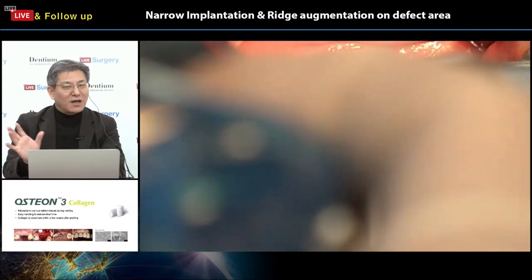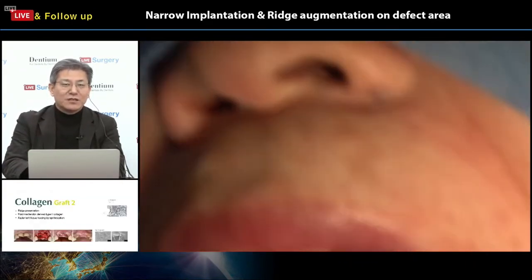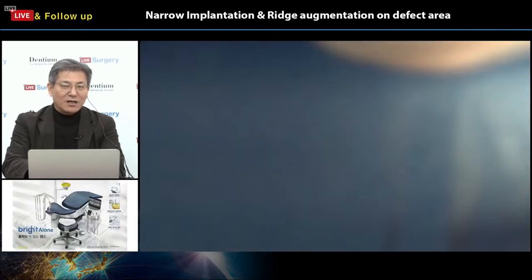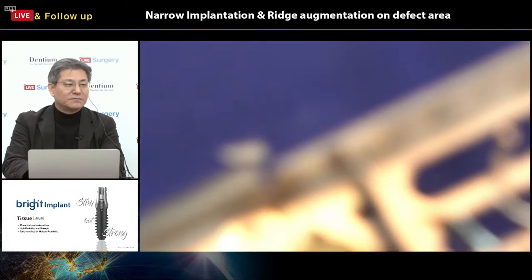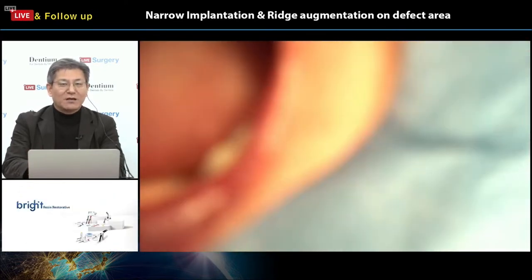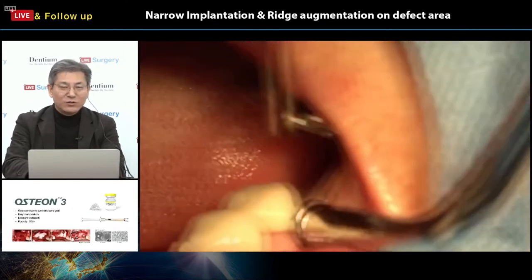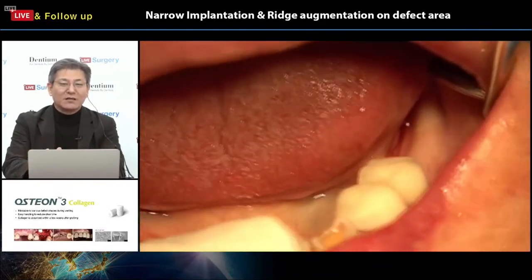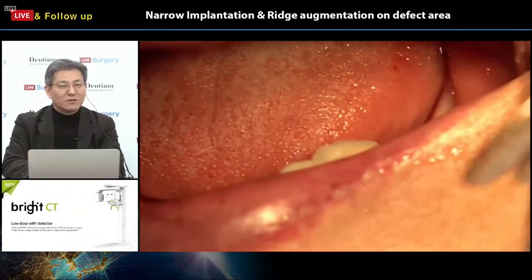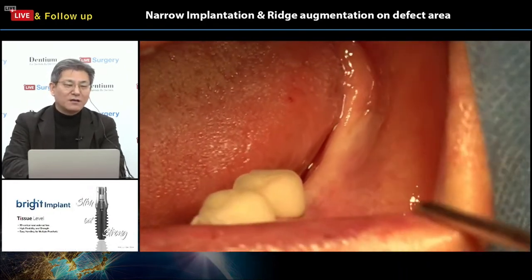So some other surgeons inject this PDRN with the graft materials. Before the graft materials are put in the defect site, some doctors mix the PDRN with the particulated graft materials. And some doctors find it easy to make PRF, and some want to use growth factors. Some want to use PDRN, different ways, but the goal is the same, faster and better new bone formation, right? So we are going to have many different ways, trial as a necessary part to make a good result.